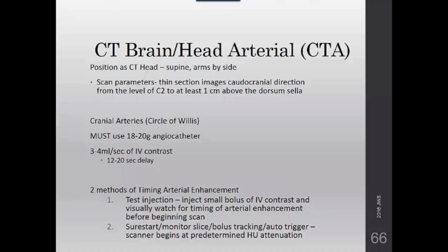So after the acquisition of axial images, they're formatted into various coronal, sagittal, and oblique planes.